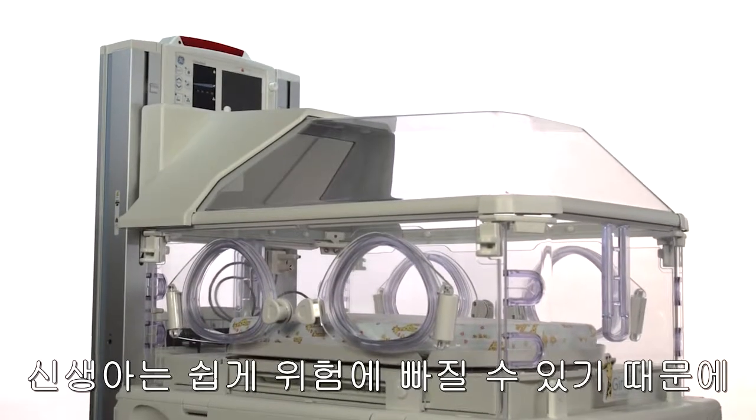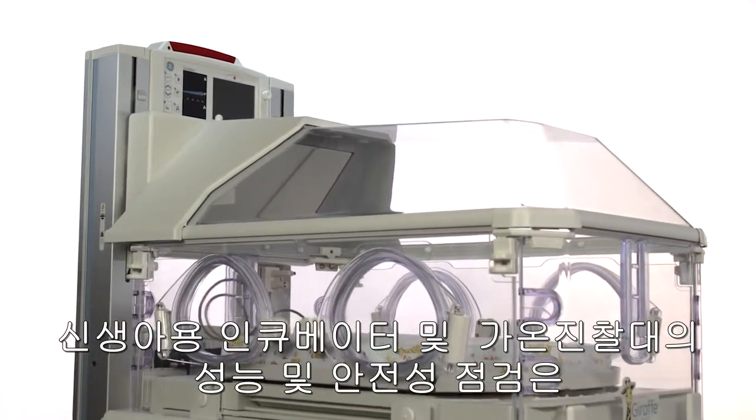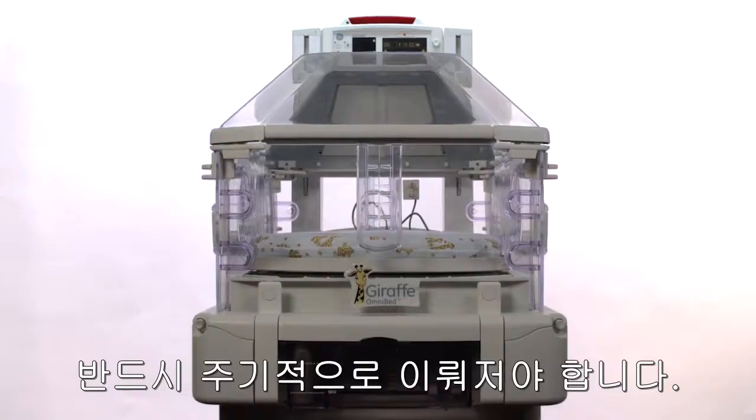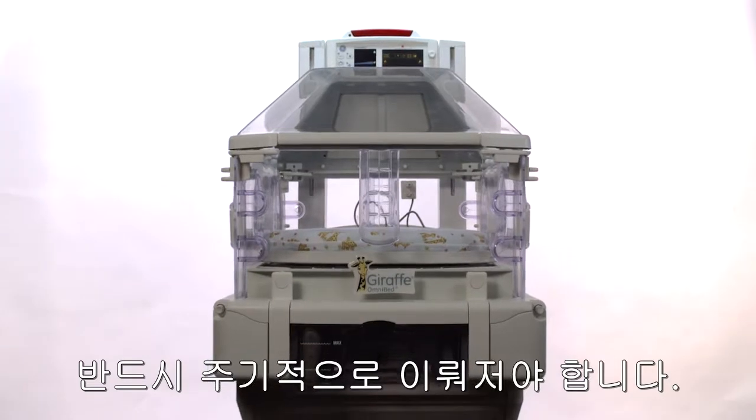Your smallest patients can be your most vulnerable, which is why it's essential you regularly test the performance and safety of your facility's neonatal incubators and radiant warmers.